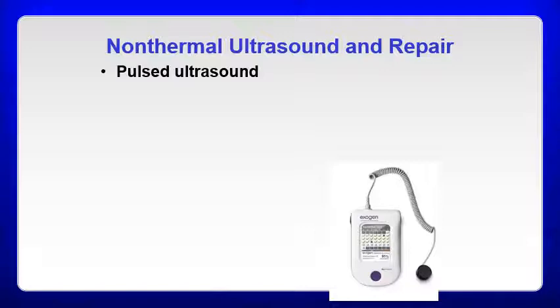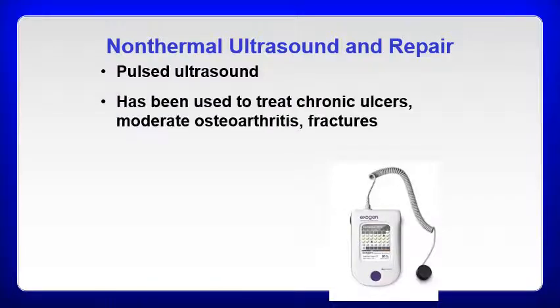So there are mechanical effects that do come out of applying sound energy to the body part that could enhance things, particularly through the repair process and even with inflammation. So they've used this in various ways, and that's where some of the research has come from, to treat chronic ulcers, moderate osteoarthritis, and fractures.